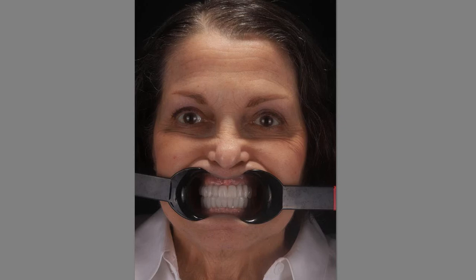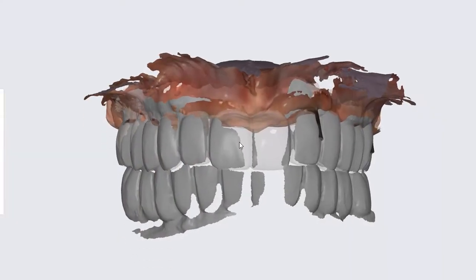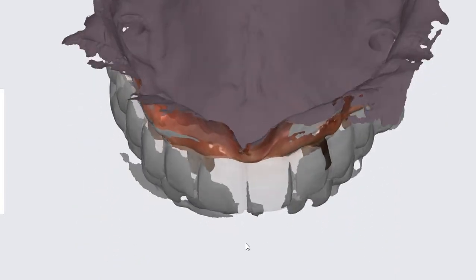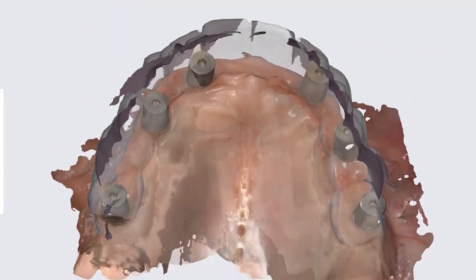The more pictures you have, the better it's going to be. Use this to get the ideal lip position, incisal edge, and also so I can figure out the buccal corridor or where to flare out the teeth. This is basically my workflow for a full upper and lower arch after the surgery is already completed. Good luck.